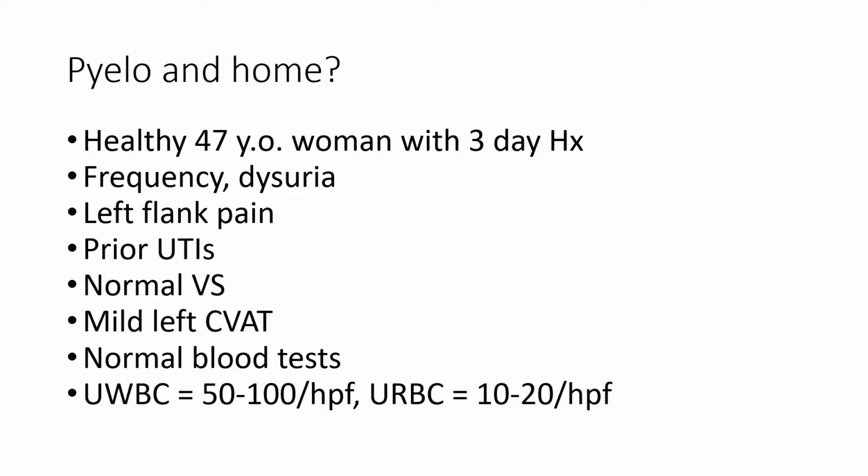You are about to send her home on antibiotics, but then because her pain seems a bit worse than the average pyelo, you decide to put the probe on, and here's what you see.